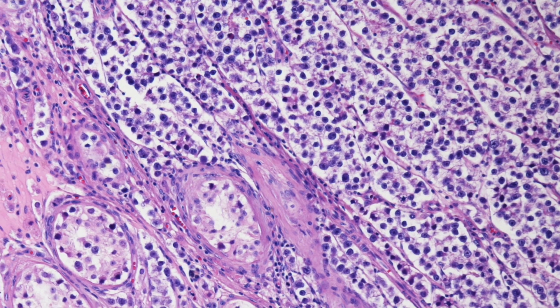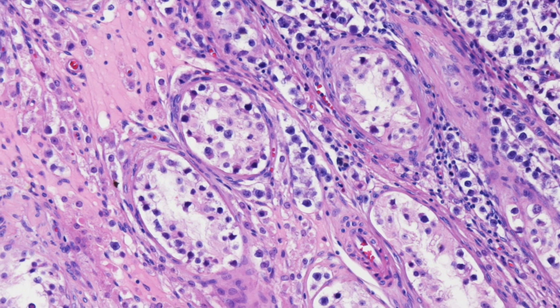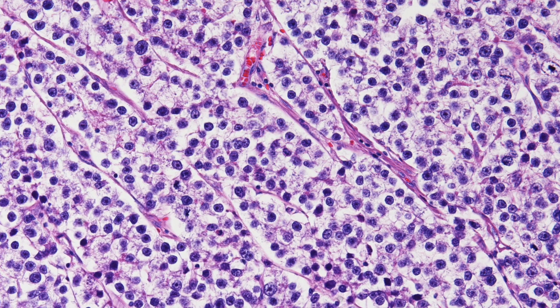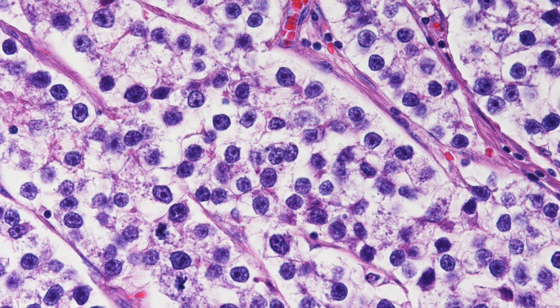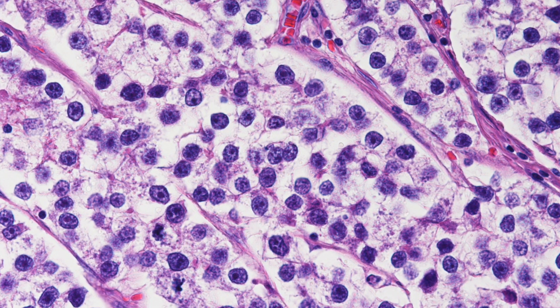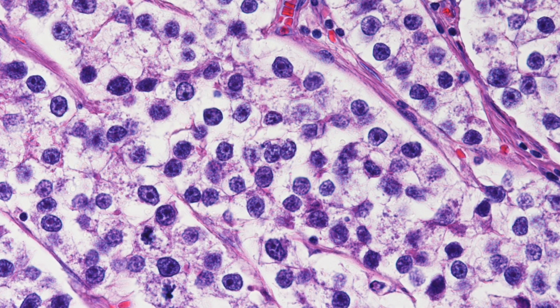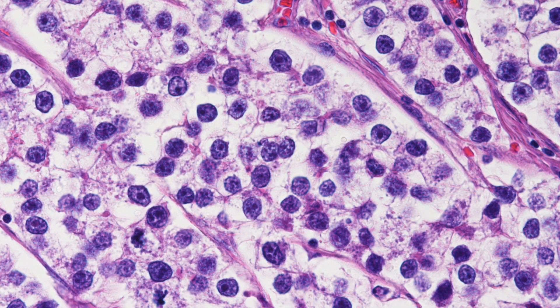On low power you can see the infiltrating classical seminoma on the right of the field, and as we zoom towards the left you can see intratubular germ cell neoplasia, where the seminiferous tubules contain the seminoma cells. At higher power you can see the sheets of cells with uniform nuclei and fairly abundant pale cytoplasm, and at a higher power the prominent nucleoli are obvious. A clue to the diagnosis is the markers — in this case just a raised LDH with everything else normal — and the age of the patient. In seminomas the typical age is around 40.